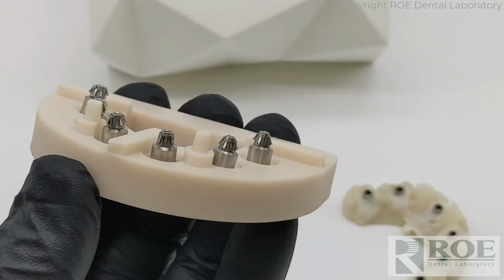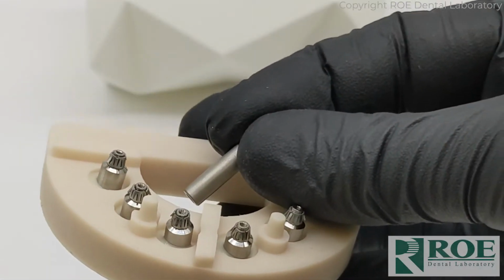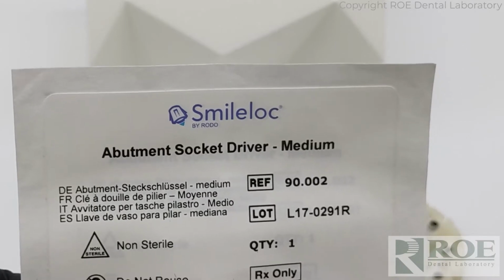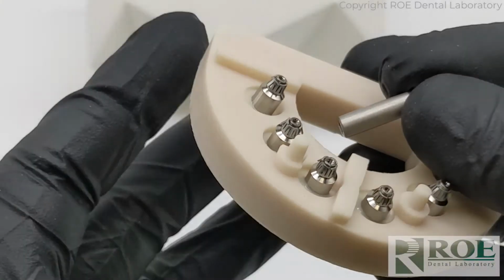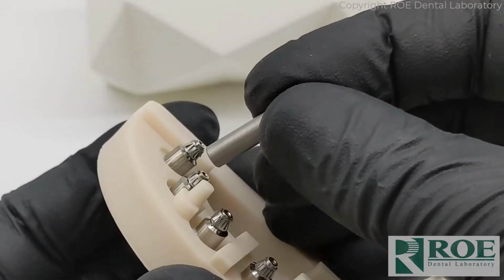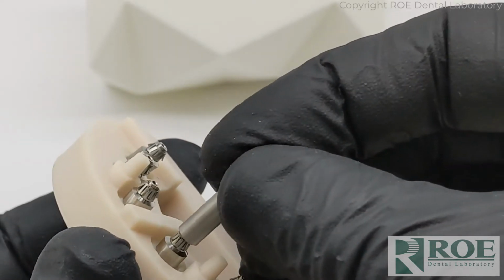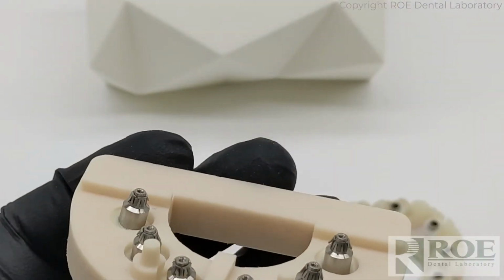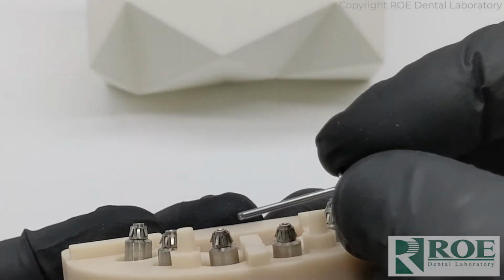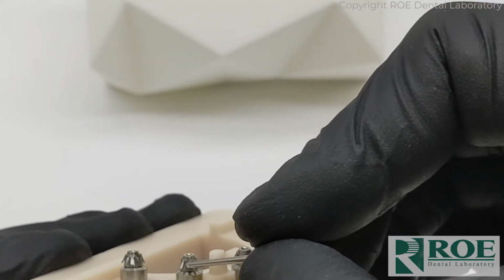All of the Smilekeys are down, and this tool here is called the abutment socket driver. And what you'll do is you'll use this just to make sure that the Smilelocs are down. You'll hear them make a little noise when they clip into place, and then you know they're down. Once you hear the click, you know they are, but you can still test them just to make sure they spin. So they'll spin a little bit, then you know they're actually down.